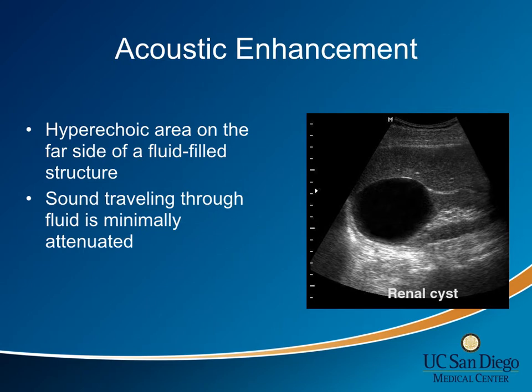Acoustic enhancement can almost be thought of as the opposite. Here, there is no return of sound waves as they travel through a fluid medium. It isn't until they slam into the wall deep to the fluid collection that they send back an enhanced acoustic signal. We frequently see this when looking at the gallbladder or urinary bladder.